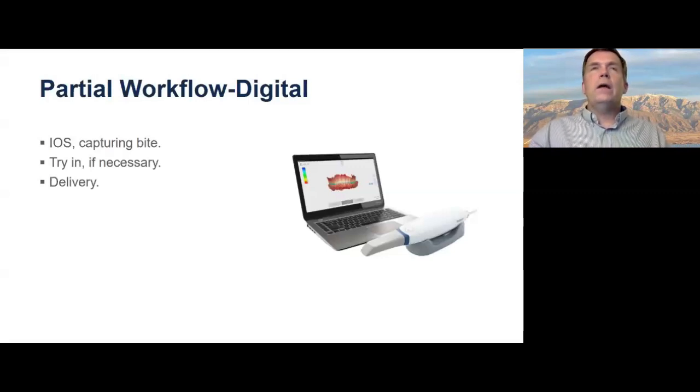If you're doing a smaller partial, you can do scan and deliver. So all of a sudden now you're down to 2 appointments. Sorry, not 2 bites, two appointments. And this is going to be a much more financially realistic workflow for you.